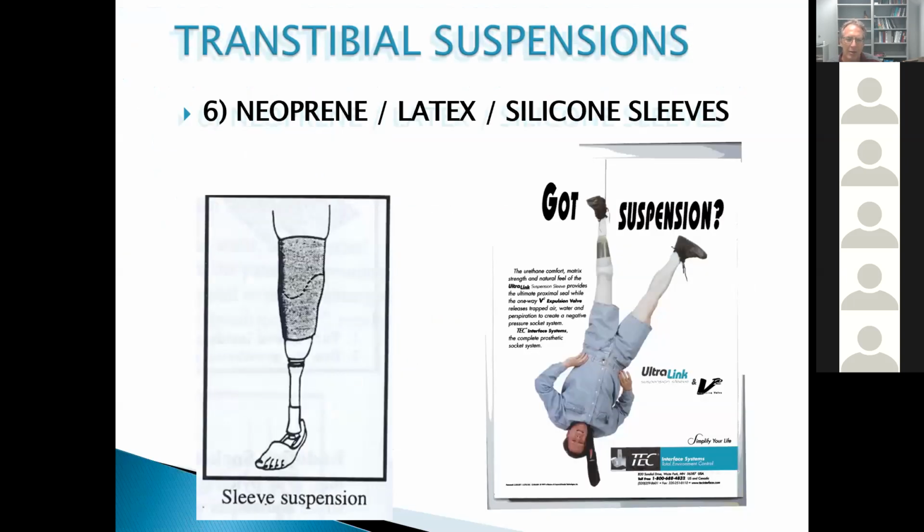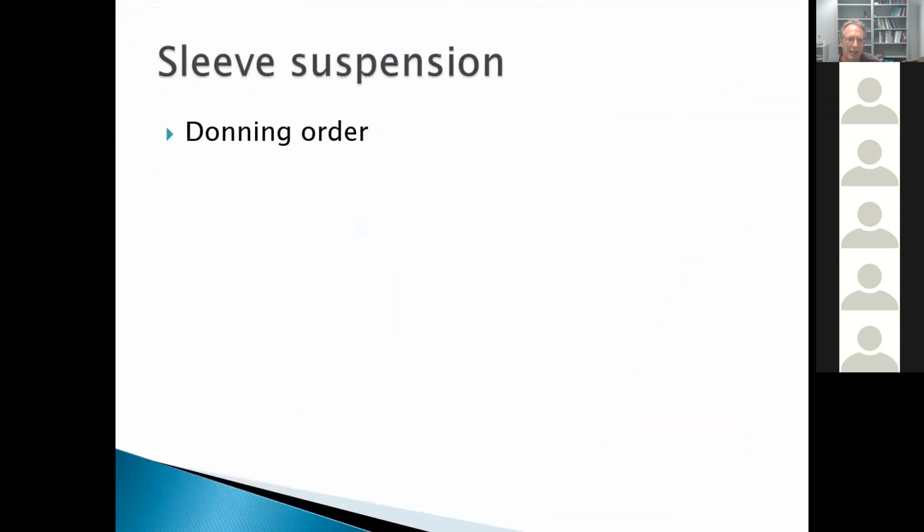Okay, here is a picture of a sleeve suspension, and how that works is that a person will put on the socks. I actually have something more to show you here. I couldn't find this the other day, but then I did. This is an example of what is called a stump sock still. If you could actually feel this, this is rather thick.